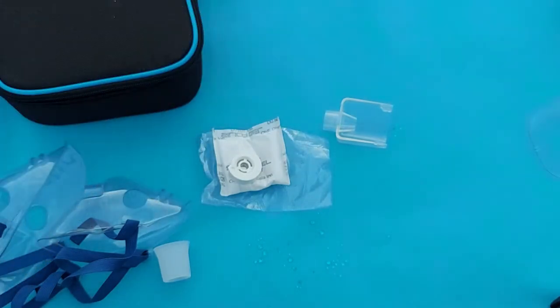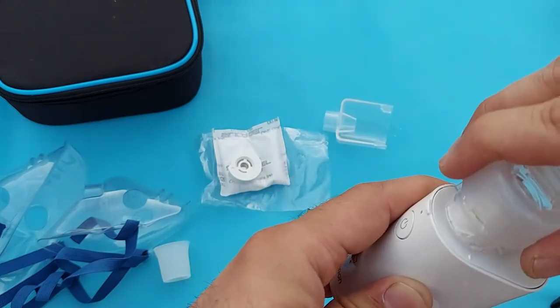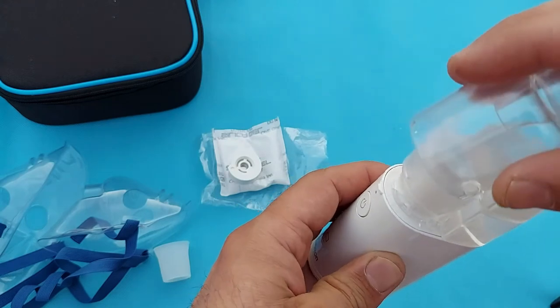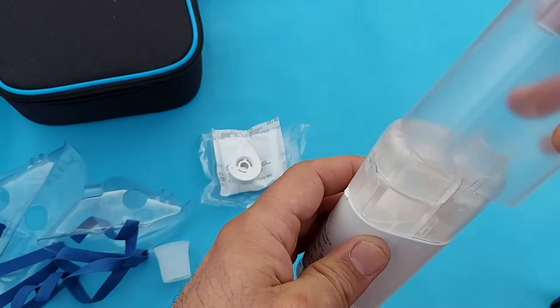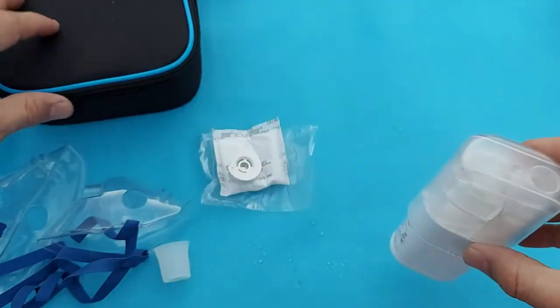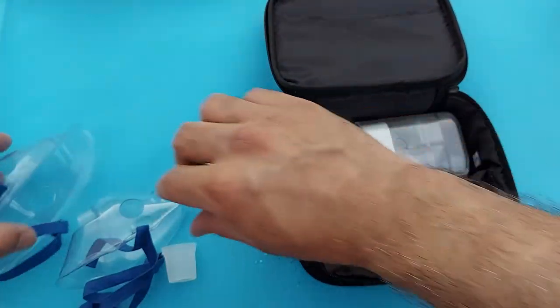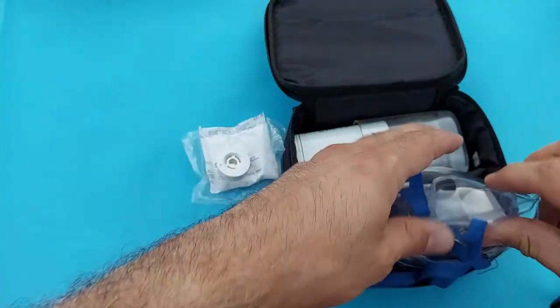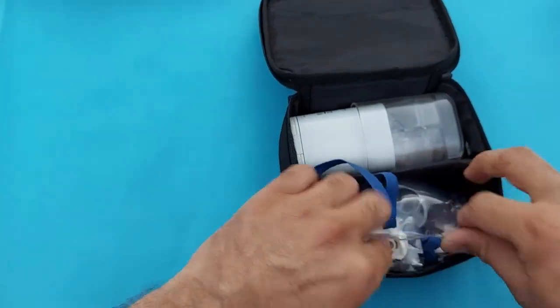Clean the device with a cloth, then put all the parts back into the device. Keep the medication container back in place. All disassembled parts should be assembled again. Keep the plastic casing on — this will keep the device safe. Place it in the carry bag along with your mask, mouthpiece, and the mesh cap.